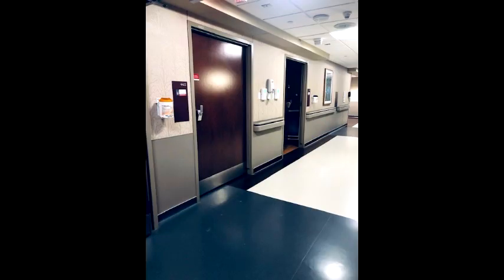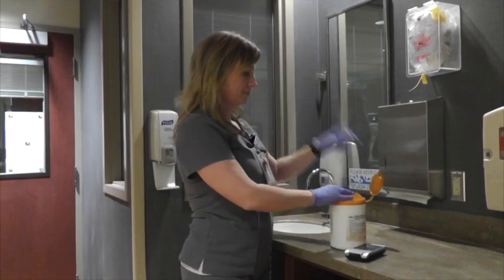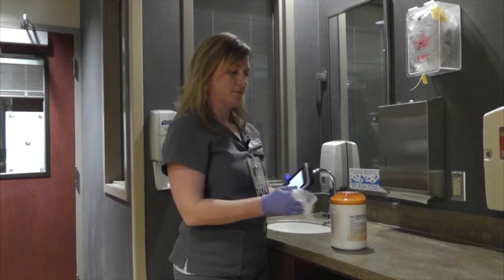What disinfectants do I use? We use the gray AF3 wipes and the orange top bleach wipes. The use of the disinfectant must follow the manufacturer's instructions to effectively kill the microorganisms on the equipment. The item must remain wet for a specific amount of time called a wet time.